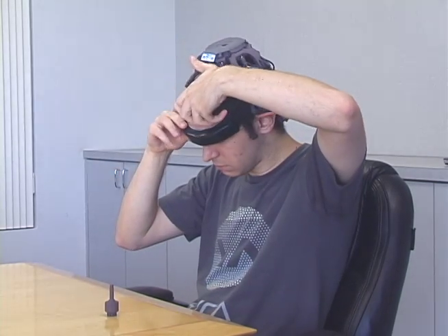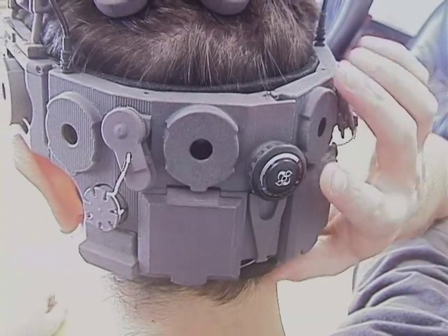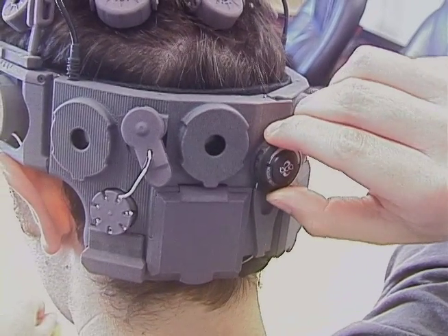Don the headset from the back to the front, pulling down the back of the headset before pulling down the forehead strap. Clear your hair out of the way of the strap to ensure good contact for the electrodes. Tighten the headset using the rear adjustment — push in the knob and rotate clockwise to tighten.